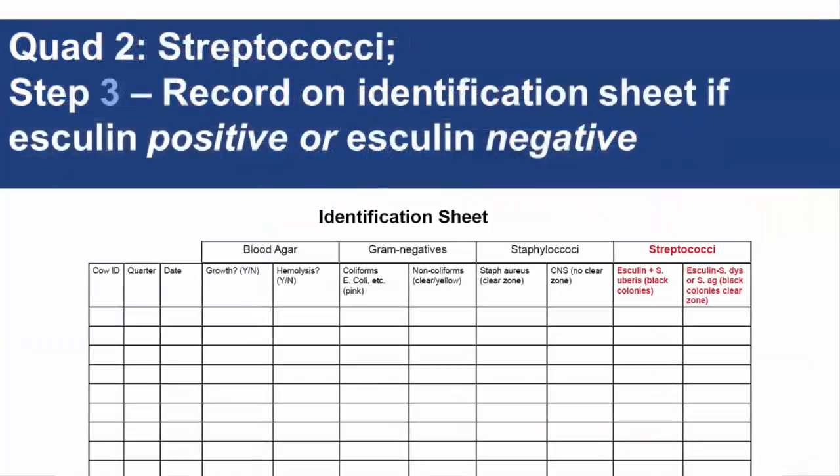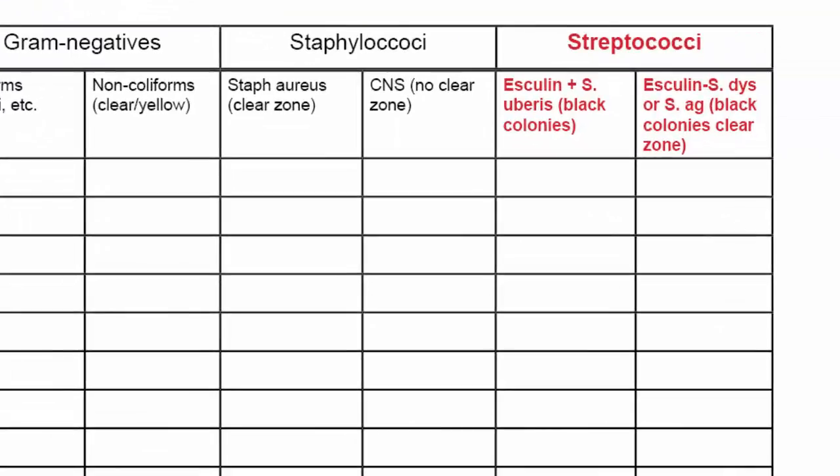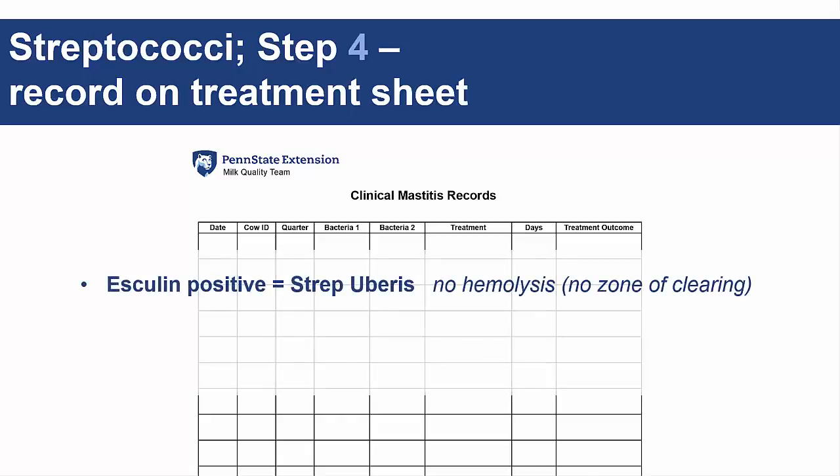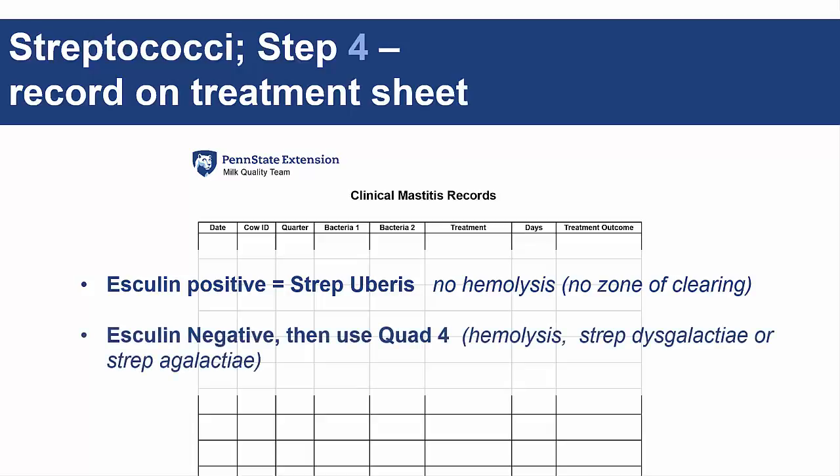Step 3 is to record on the identification sheet whether the colonies for quad 2 are esculin-negative or esculin-positive. For step 4, you'll record the colonies as strep uberis on the treatment sheet unless you found esculin-negative colonies. If E-positive colonies with no hemolysis, write strep uberis on the treatment sheet. If E-negative colonies are present with hemolysis, use quad 4 to determine bacterial species — will be strep dysgalactia or strep agalactia.